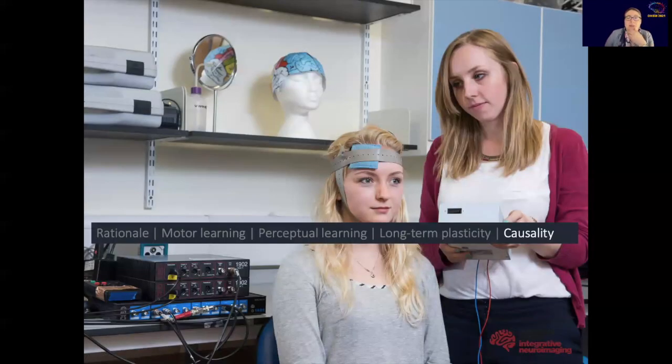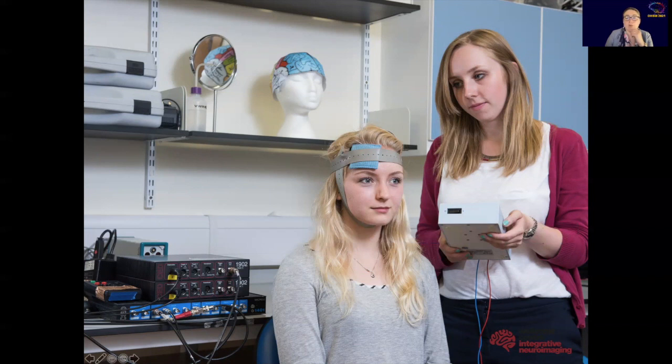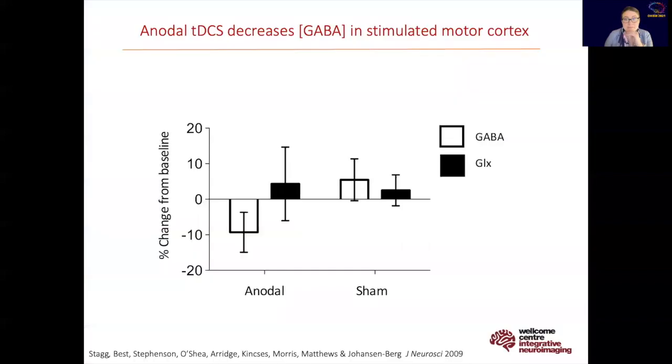The final thing I'm going to talk about is the combination of MR spectroscopy with non-invasive brain stimulation to go beyond just correlation. In this case, we use transcranial direct current stimulation, where we put a 1 or 2 milliamp current through the brain via 2 electrodes placed on the scalp. We know that it modulates cortical excitability for a few tens of minutes, and we know that it can modulate behavior. So the first question we asked was, does it change GABA levels? If you're inducing this kind of increased excitability, a proplastic state, do you see a decrease in GABA as you do that? And indeed we did.